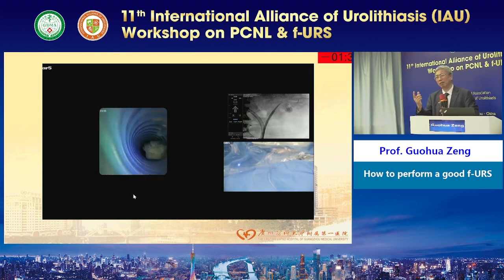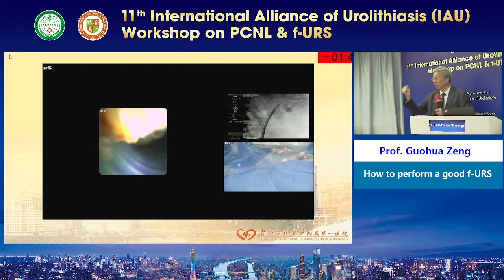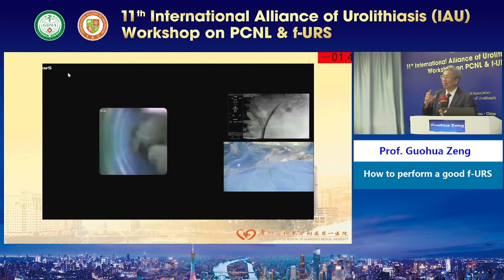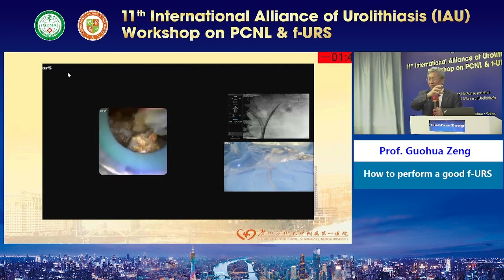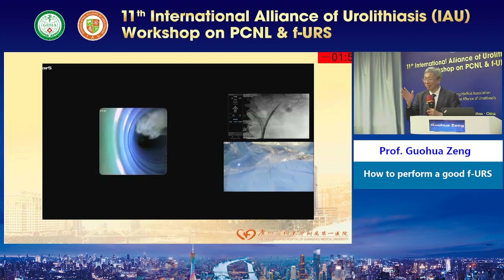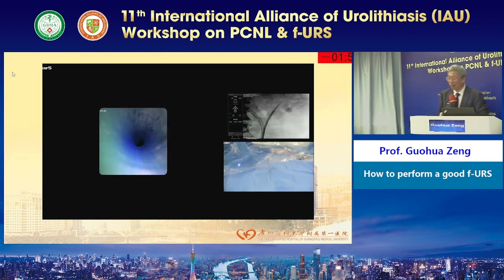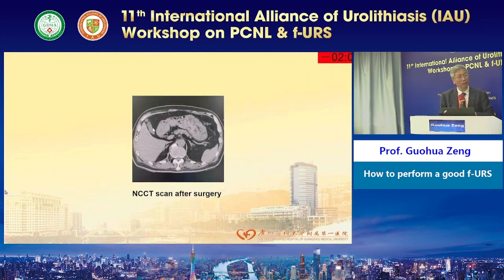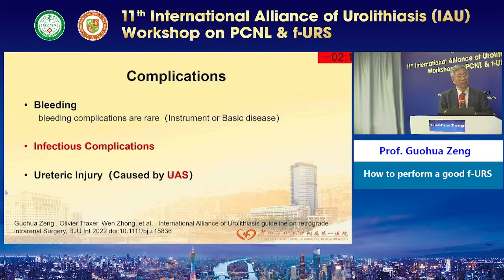But sometimes you do a bigger stone, 2 centimeters. After the operation you are very tired. Maybe it takes a long time. So I compare basket and this suction sheath, which is better. I will do this clinical trial. Oh, see, last stone left. I can suction. Complications I cannot talk about, because in the next talk Professor Campbell will talk about this.